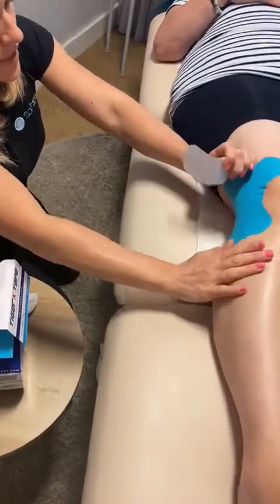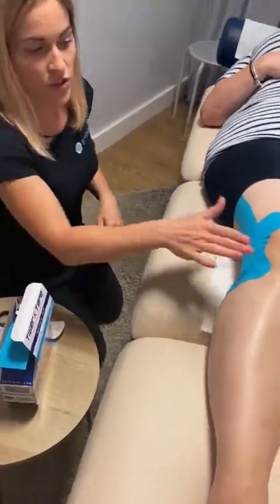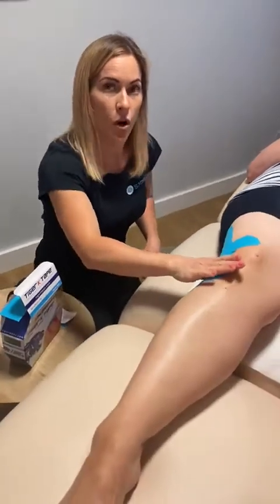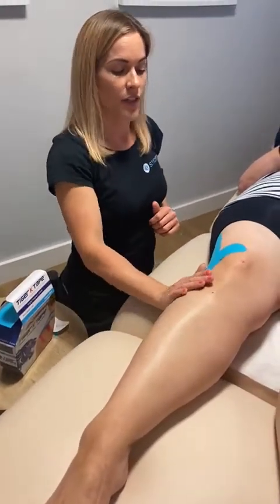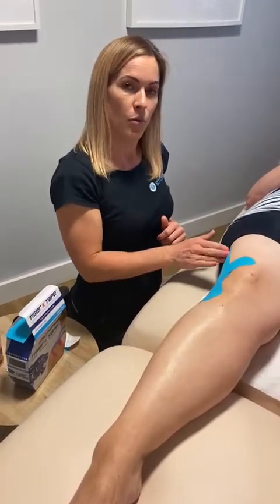Okay, all right. So that should be absolutely plenty for you. If you feel like you need an anchor, you can absolutely pop one over the top, but that should be absolutely fine for you. This should stay on for about 3 to 5 days, and that should really help to support that area.